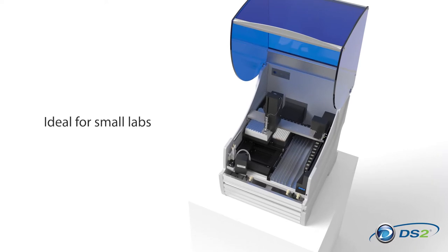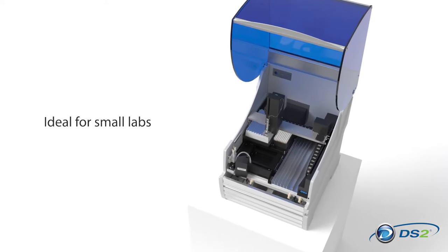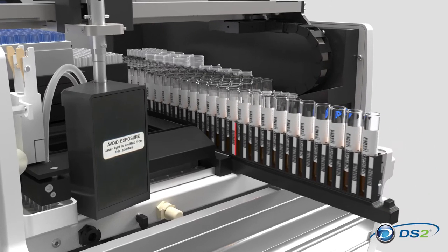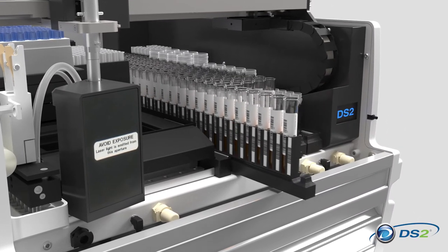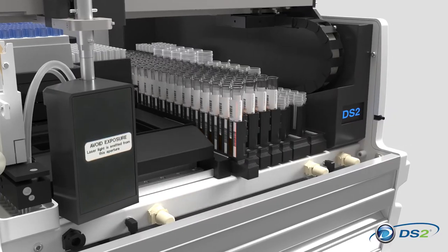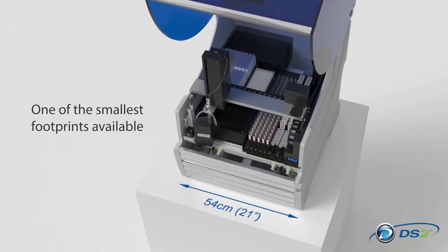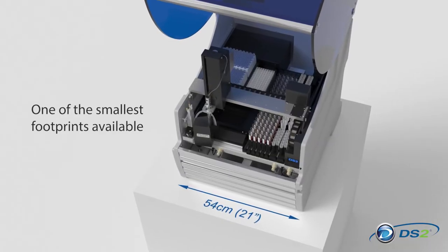Ideal for small labs, the DS2 offers walk-away automation with an onboard capacity of up to 100 samples, all in one of the smallest footprints available.